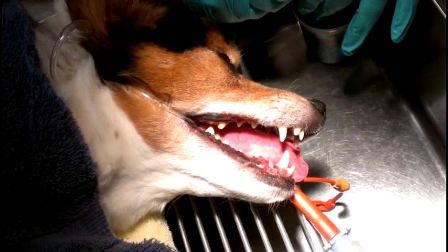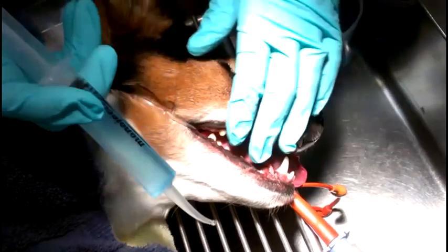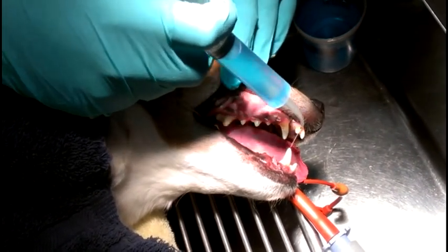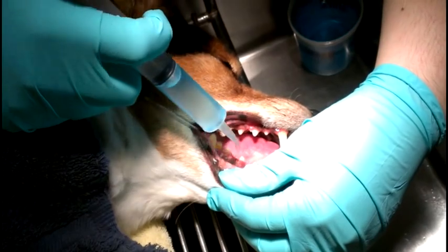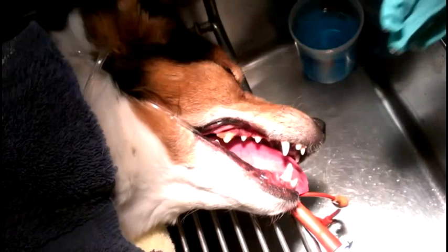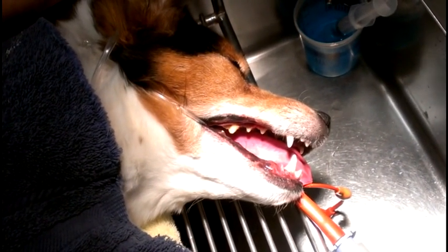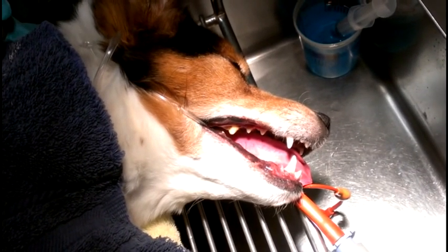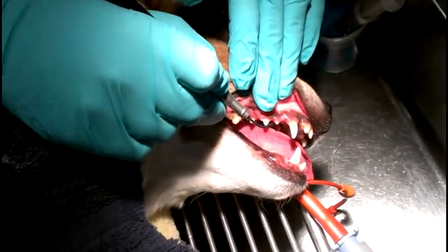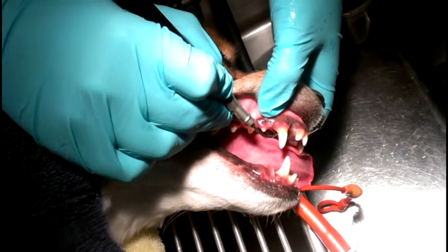So the first thing I'm going to do before I start cleaning is take a little bit of this. This is chlorhexidine. It's just an antibacterial mouthwash. I'm just going to wash the teeth with that. That's going to help keep a lot of this bacteria from getting aerosolized when we start cleaning. We use an ultrasonic scaler to get the tartar off the teeth. And that just uses high-frequency sound waves and water to blast this off of here.